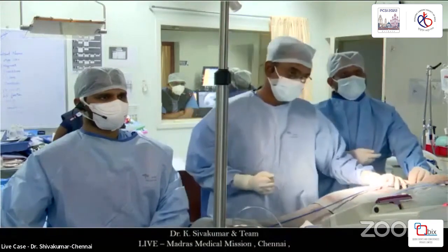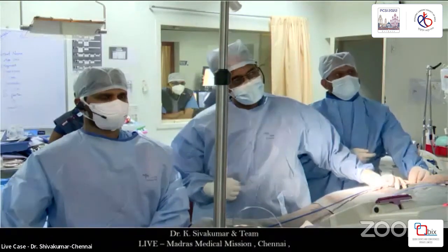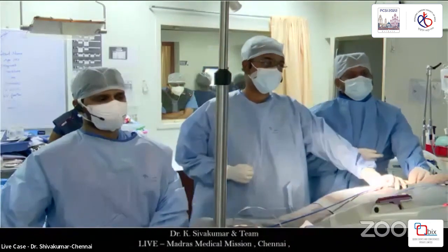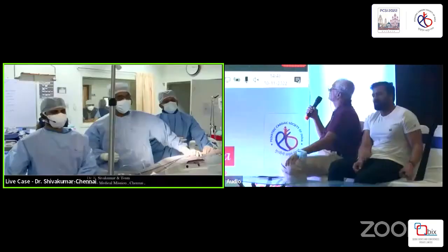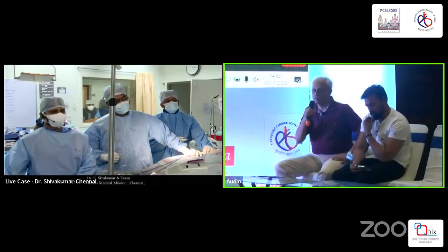Shiva, I had one question for you. What numbers would make you not go ahead with the Venus P valve? I mean, now this is 32, 33. I agree that the main pulmonary artery is quite acceptable dimensions, but what are the numbers which will make you say that, no, I don't want to do it percutaneously?